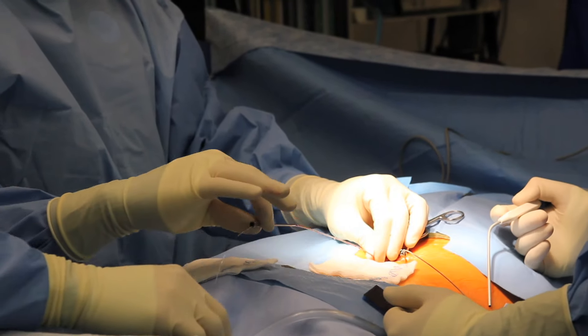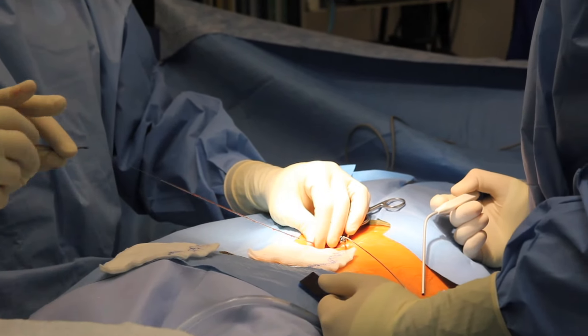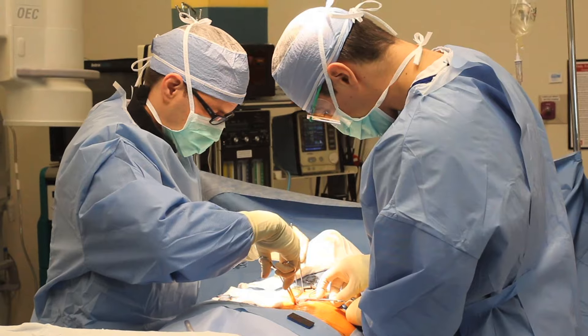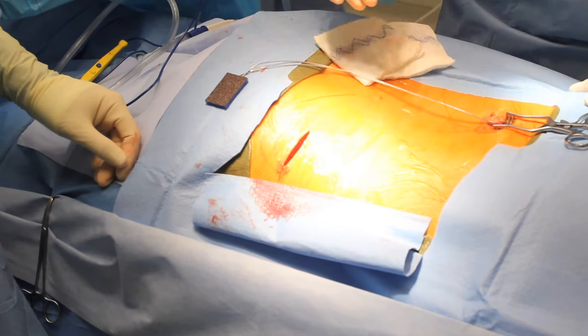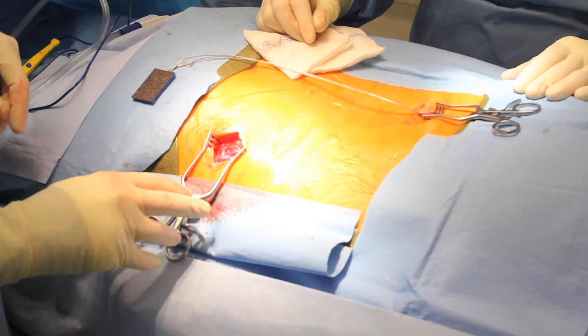Once proper placement is ensured, sedation is deepened and a small skin incision is made between the needles and at the predetermined level in the buttock for placement of the computer battery.